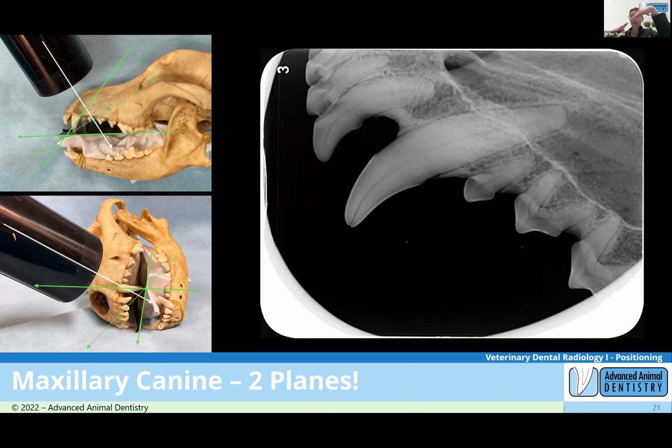So it's not then angled within the mouth itself. It's just coming in absolutely flat, and that takes that other little bit of distortion out of it and makes things a little bit easier for you to actually get your angles right in a particular shot.